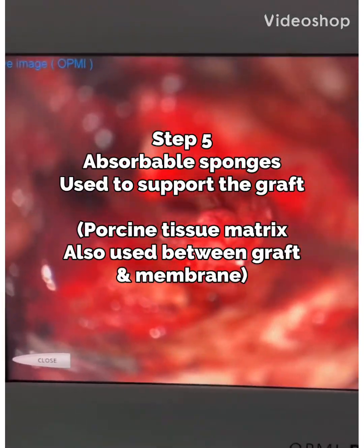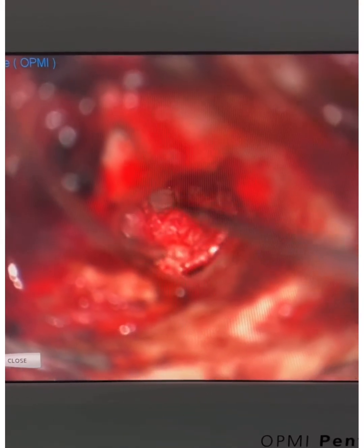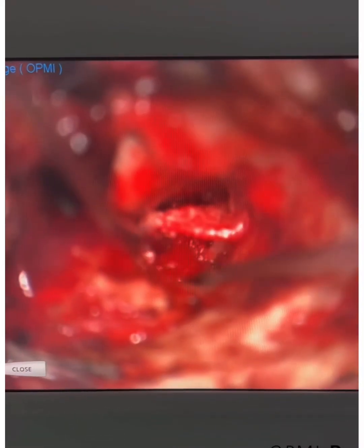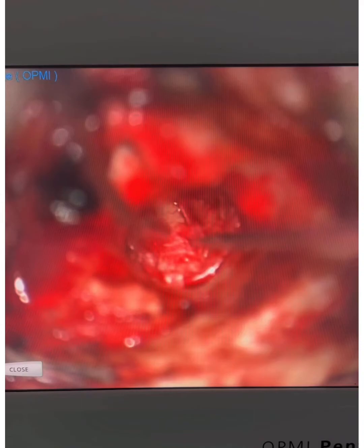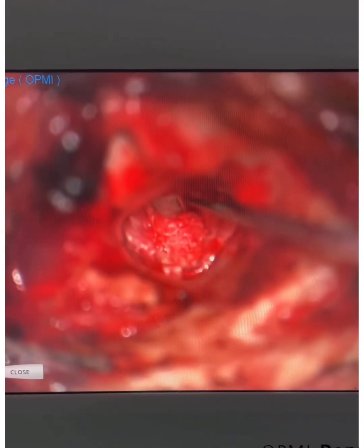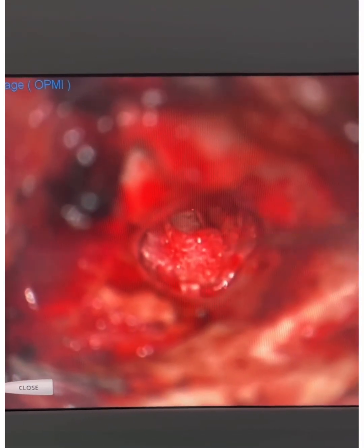You can see here we slid our cartilage in from the underside right here and it is closing this entire hole right as we planned. I supported it on the under surface with these little sponges, then we lay the eardrum back down into position — just like that — close up, and voila! The patient does not have a hole in their eardrum anymore. I hope you guys enjoyed seeing that — she's going to do great!